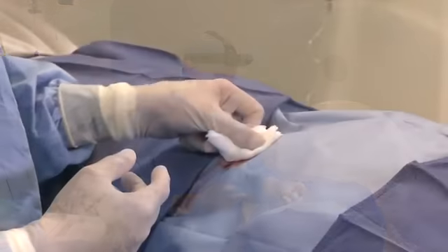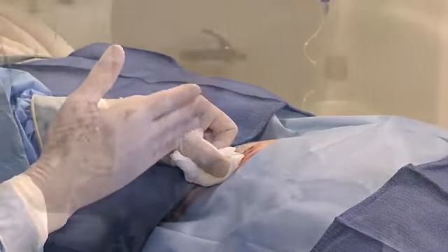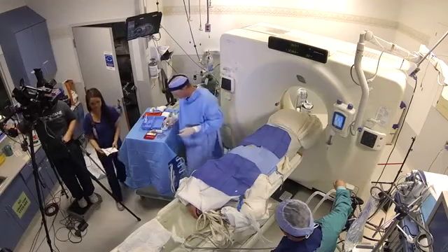But I do warn them that in a few days, as the healing sets up, paradoxically they might get a little sore. That's ibuprofen type sore. I tell them not pain. And it's very easily managed. But again, if it doesn't hurt the first day, it might hurt day 3, 4, or 5 as the healing and inflammation sets up. Let's go take our final set of pictures here and see how we did.